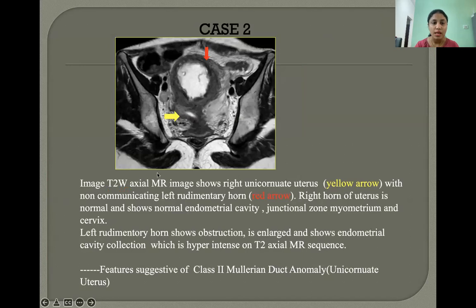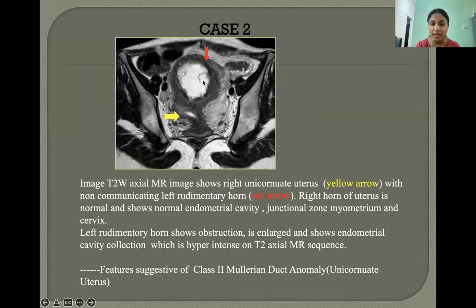Case 2: The T2 weighted axial image shows a right unicornuate uterus with a non-communicating left rudimentary horn. The right horn shows a normal endometrial cavity, junctional zone, and cervix. The left rudimentary horn shows obstruction — it is enlarged and shows endometrial cavity collection, which is hyperintense on T2 axial MR sequence. These features are suggestive of class 2 Mullerian duct anomaly, unicornuate uterus.